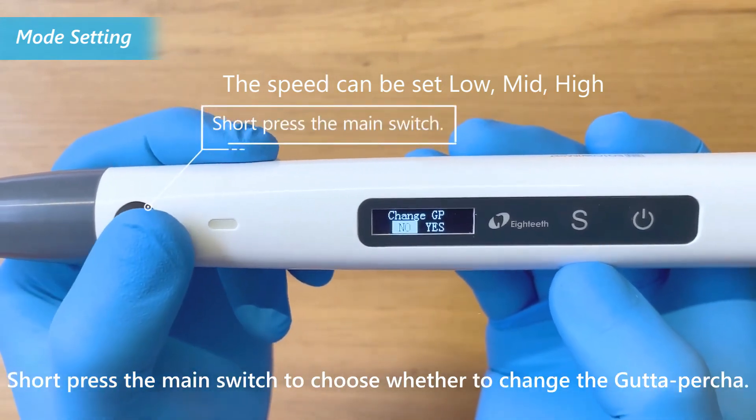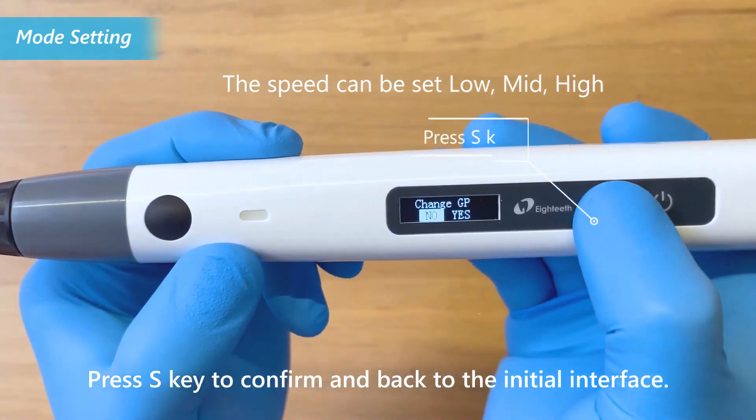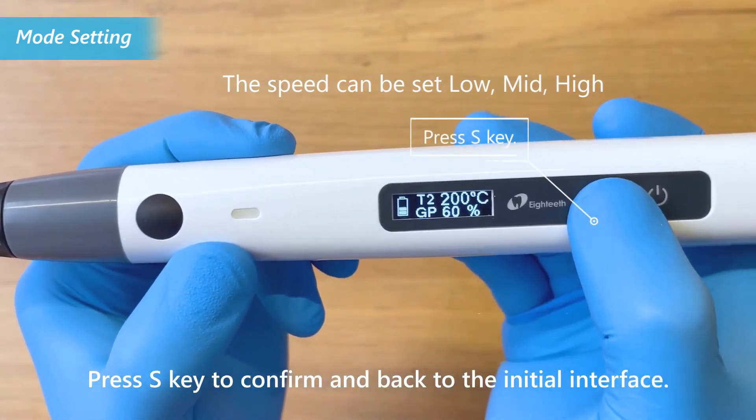Short press the main switch to choose whether to change the gutta percha. Press the S key to confirm and return to the initial interface.